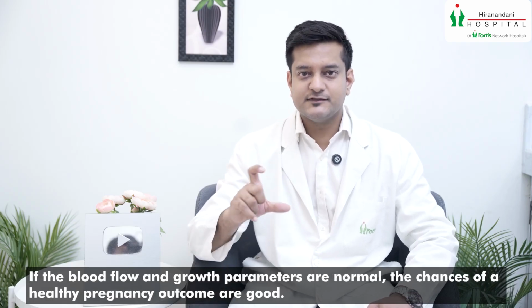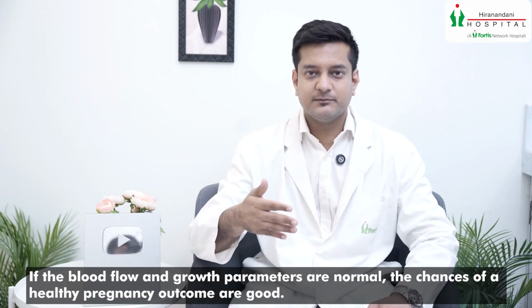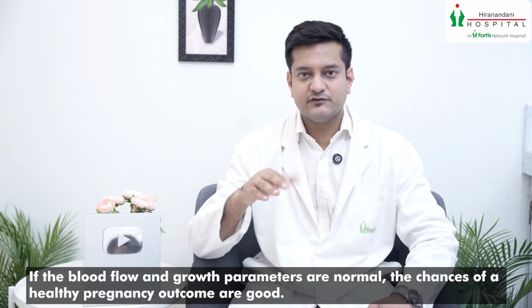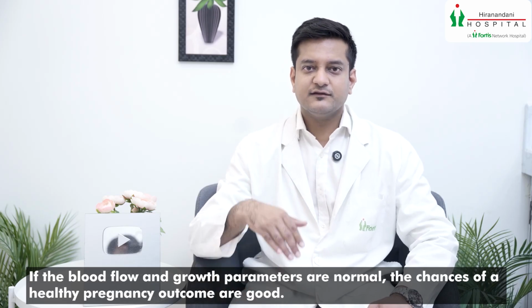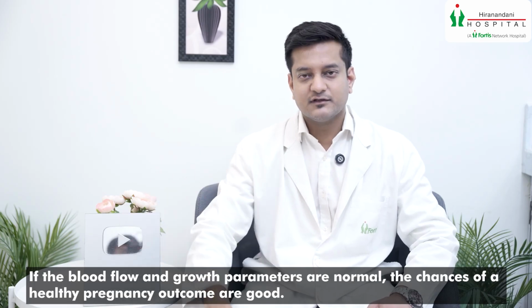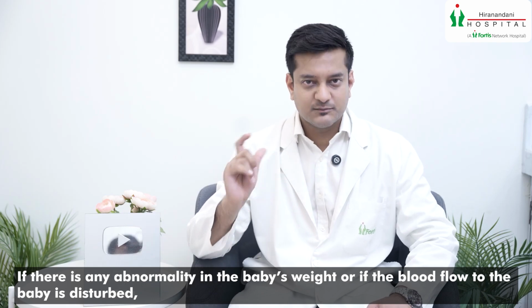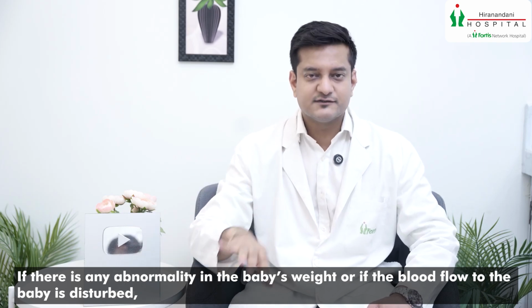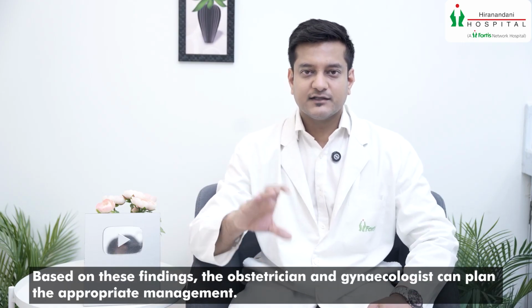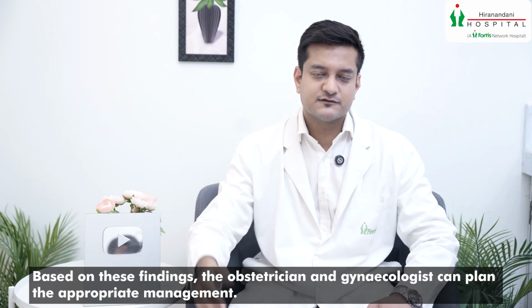If the flows of these arteries are normal, then it is expected that the baby's growth is within normal limits, and along with that, if the growth parameters, the weight of the baby, is normal and the fluid surrounding the baby is normal, then the chances of a good pregnancy outcome, delivery outcome, are good. However, in case there is any abnormality in the weight of the baby or the blood flow to the baby is disturbed, then we can pick it up through these growth scans and Doppler scans. Then appropriate management can be planned by the obstetrician and gynecologist.